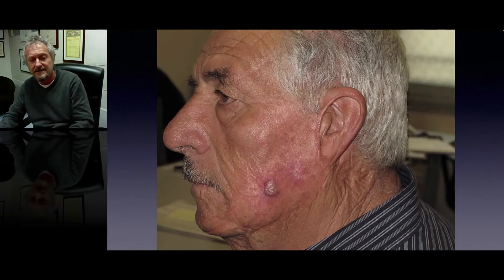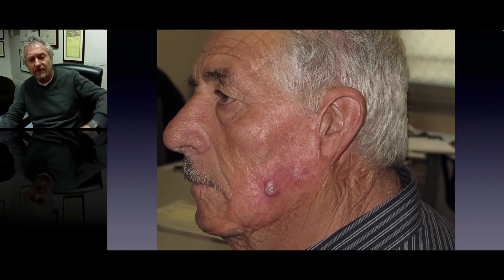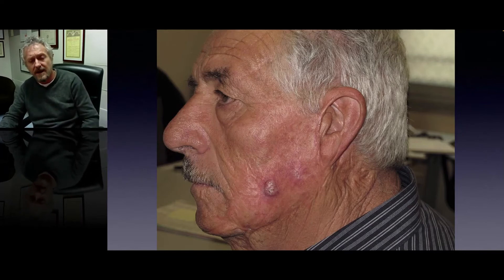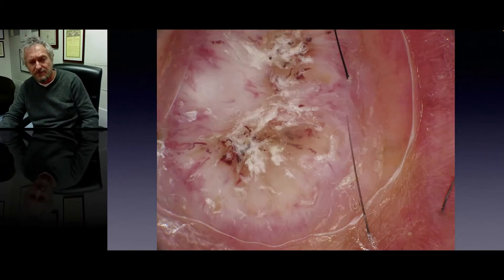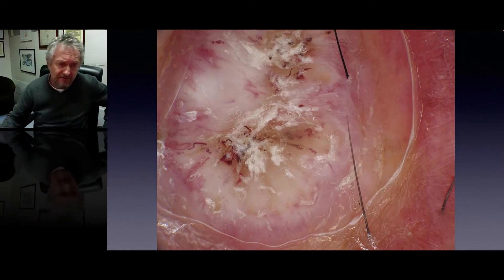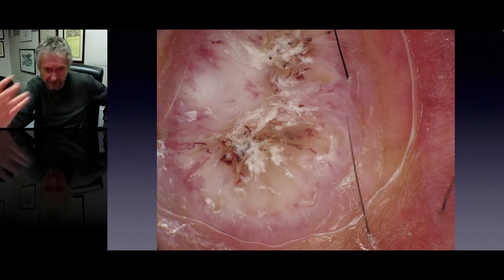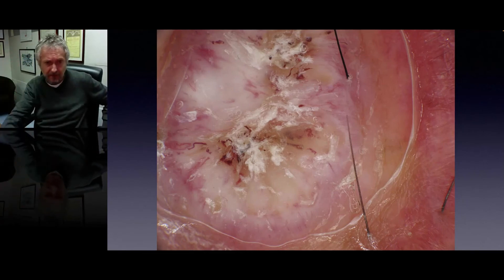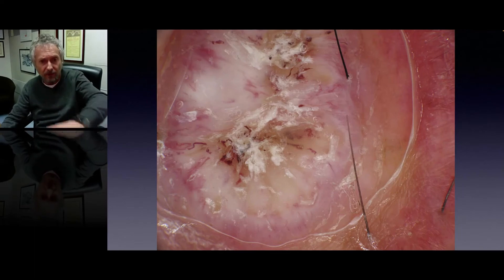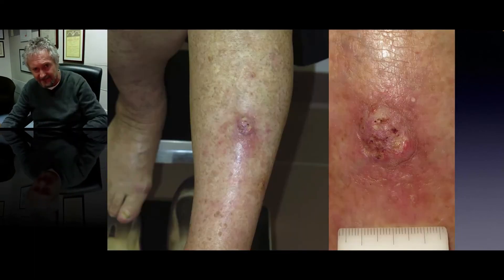Here is a good example of a squamous cell carcinoma appearing on a previous burn scar. Dermoscopically, the main clue that jumps to the eye is white color, and of course polymorphic vessels and scale crust in the center.